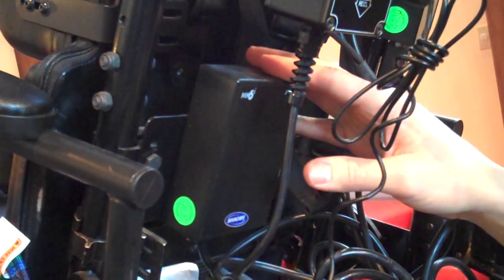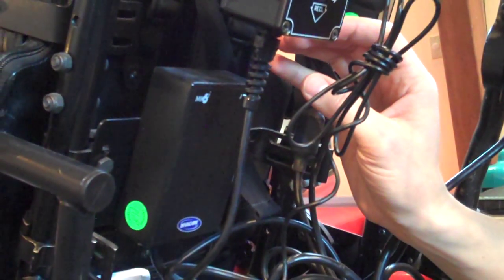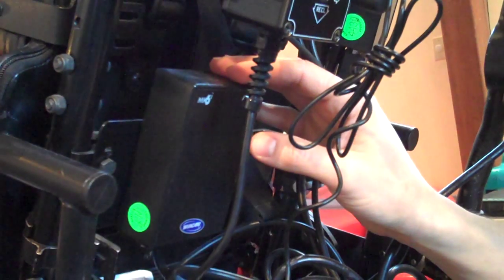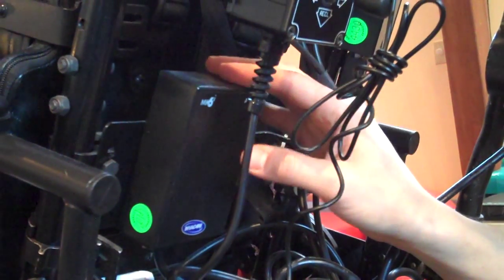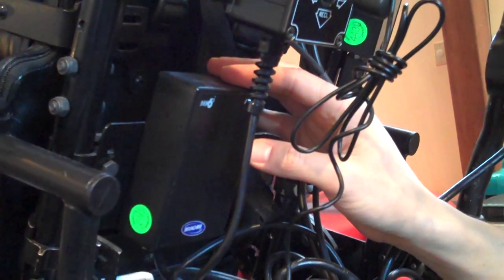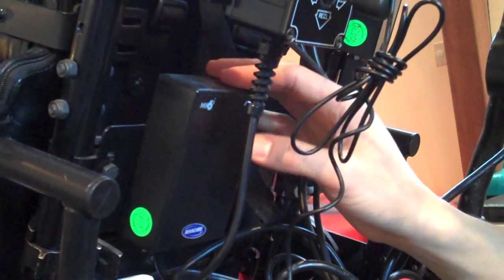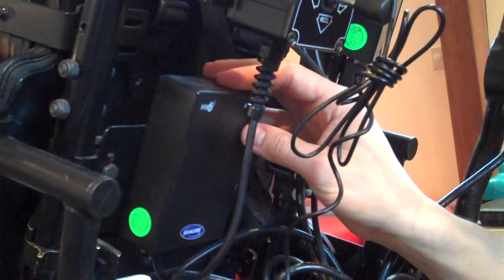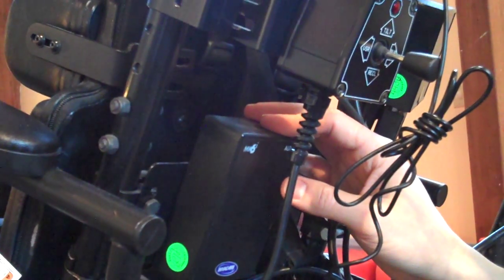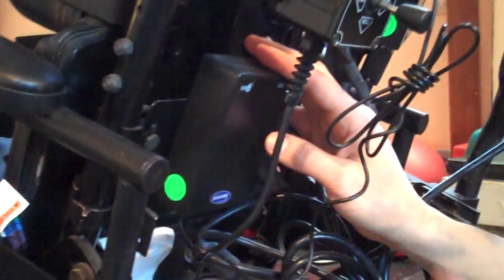This takes the signal from the power chair and turns it into a usable signal for environmental control. This is what you would plug in if you want to access your communication device through the power chair. You could use the head array not just to drive, but to control a mouse on a computer or your communication device. This gives you that signal.